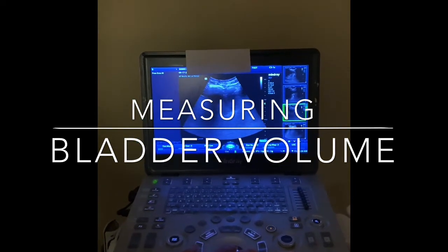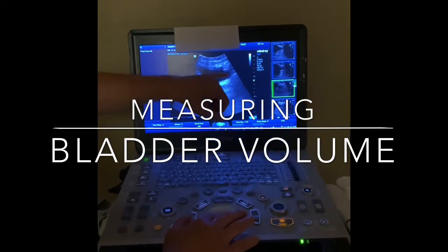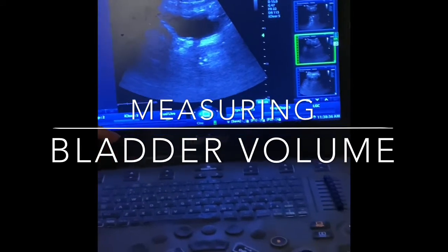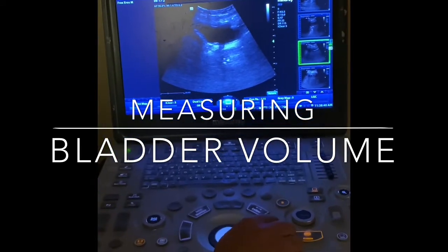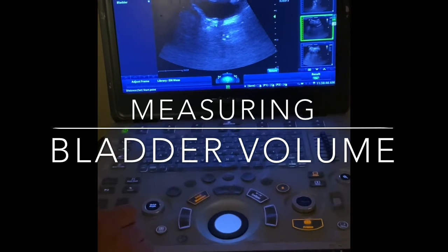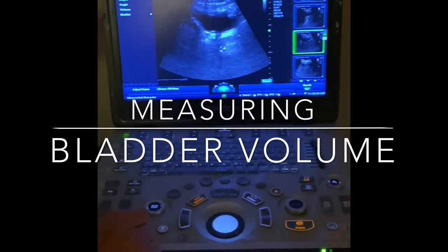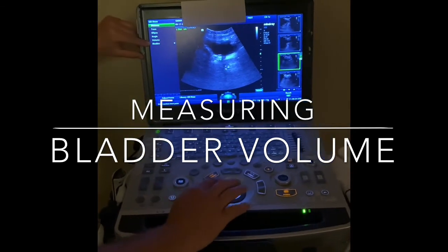What we want to do is find the bladder in its widest, in its largest diameter, and freeze the study. Once we have the study frozen, we will click the measure button because we're doing a calculation. Right now, we are on the fast preset, so bladder volume does not automatically come up. But you can see that bladder is one of the options.